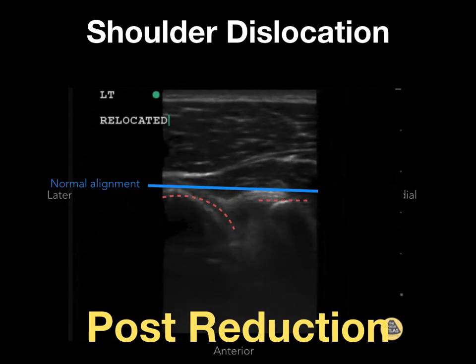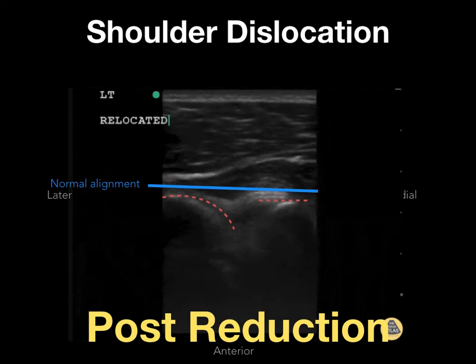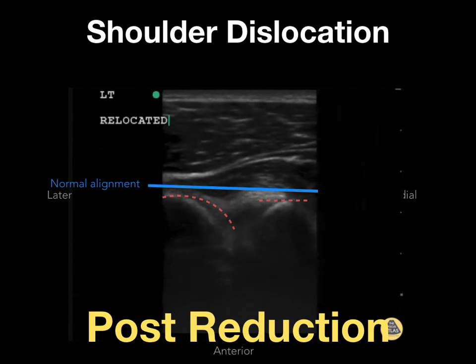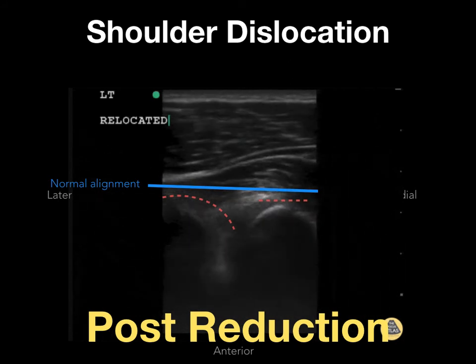This can often be a technique that's used right after reduction is complete or while a patient is still sedated and there's question of whether the shoulder was successfully relocated. This can help prevent unnecessary resedation and help expedite dispositioning the patient.